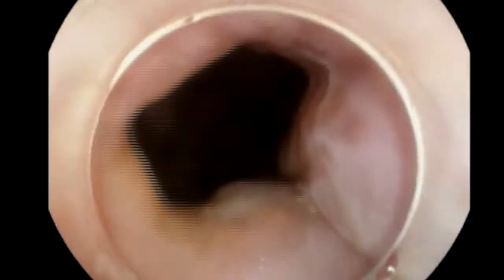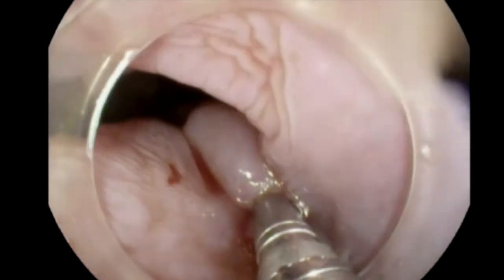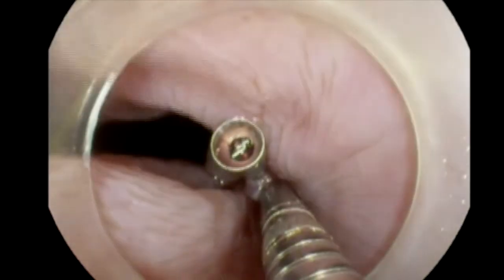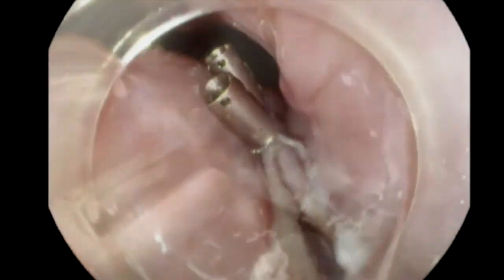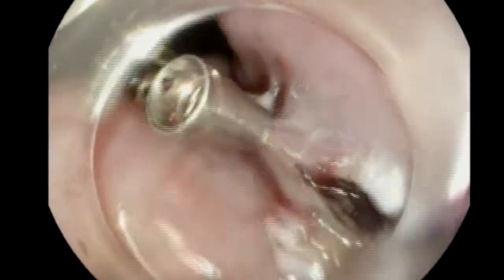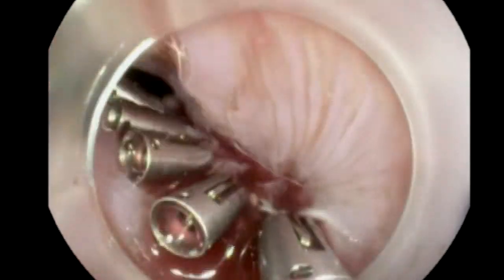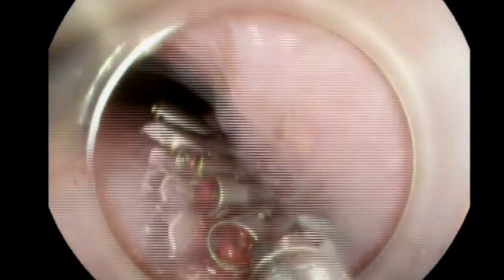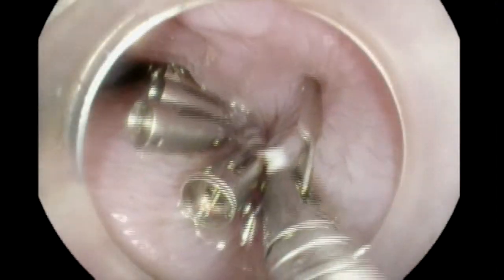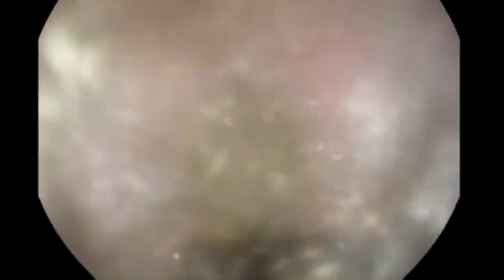We see right now that the lower esophageal sphincter is wide open. And now we are going to close the mucosa entry. As we can see, we are putting short clips. I prefer short clips because they will not hit the wall on the other side. We will put the incision side at 6 o'clock and gradually put the clips one by one in a perfect line. You would like to put the opening of the clip in the middle of the incision, not too much to the right or to the left. That will allow you to make a perfect line, which will maintain good closure of the entry site and allow you to see the spaces between the clips to make sure no additional clips are needed.